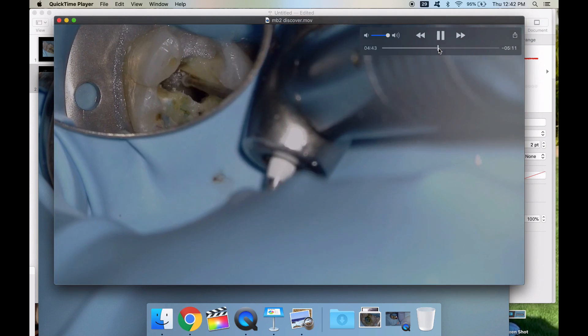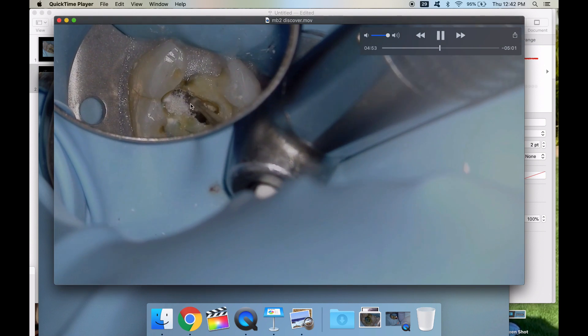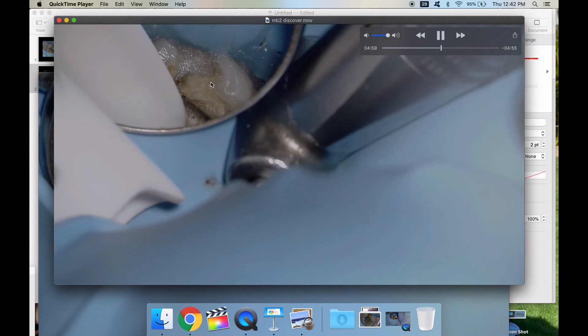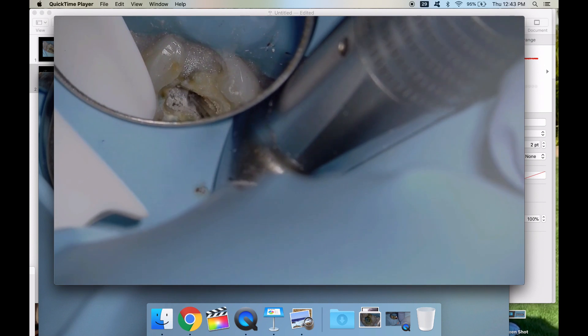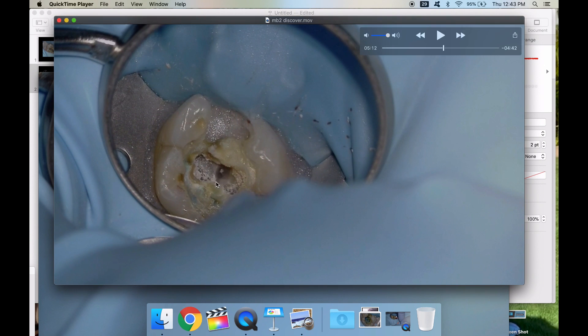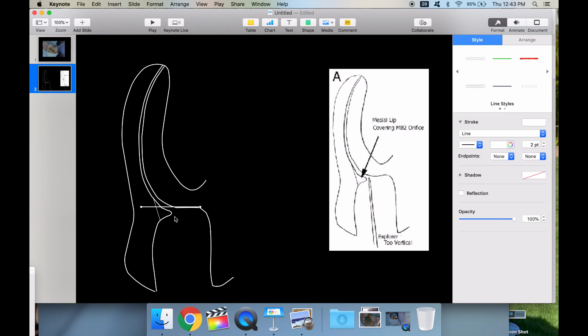You need to trough that out. I'm going to take my burr — and you can see a white dot there, that's the canal — and I'm moving it more mesial. I could remove more of this but I wanted to preserve some tooth structure because I know we can get around that bend. There it is — boom, there's MB2! It started here and as we slowly troughed, it went there. As we remove all this, you get a more straight line of access.